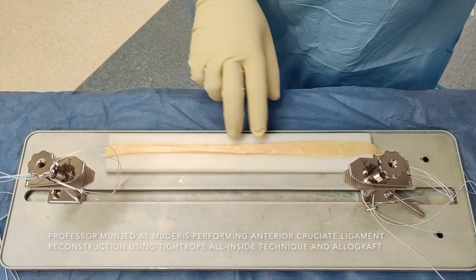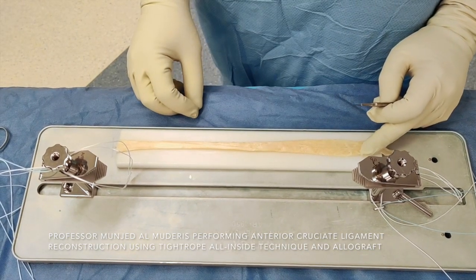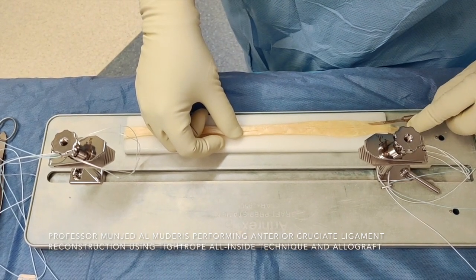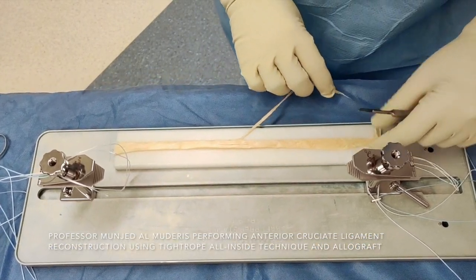After filling the graft, I trim it to the desirable size for implantation. Ideally, the graft size should be 10 to 11 millimeters in diameter in a male. I remove one third of the proximal part of the graft, and that should give us the desirable size.